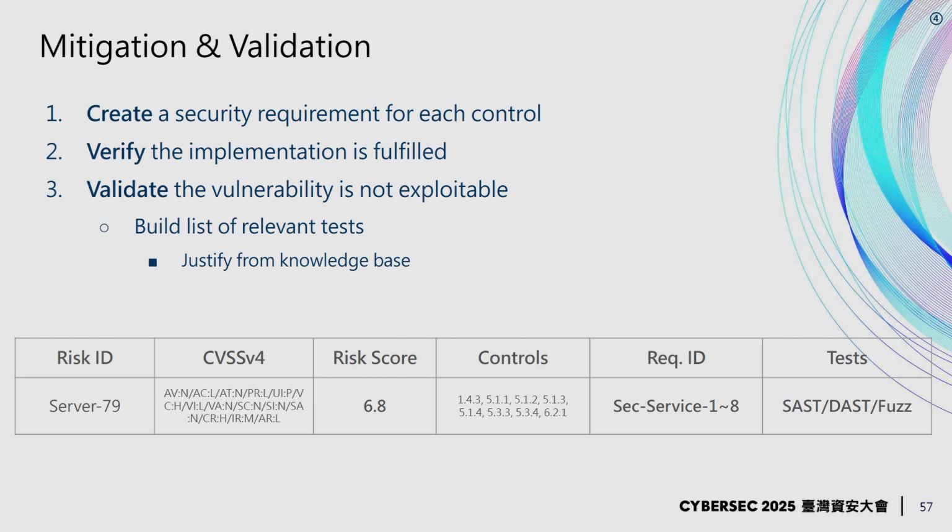And there again, look at what the guidance and the knowledge base are telling you about how you can detect a risk in your software. Typically there are multiple tools, SAST, DAST, fuzzing, load testing, and so on, that you can put in place. But you need to be sure that those tools can actually detect the vulnerability or the weakness that you are looking at. This is not necessarily easy, finding the right tooling, and even if some tools pretend they can find it, you have to be able to justify it to the regulation.